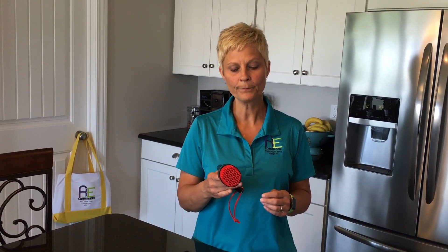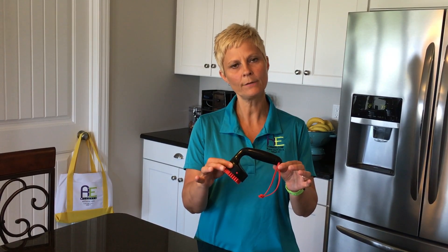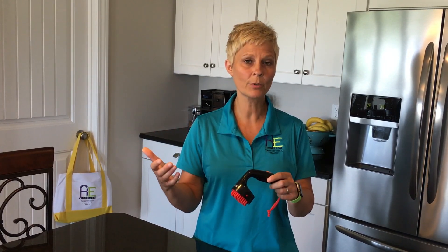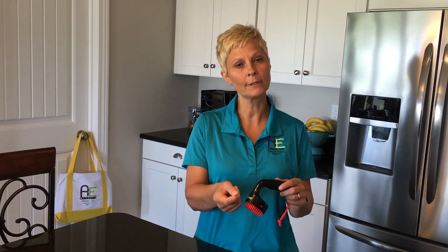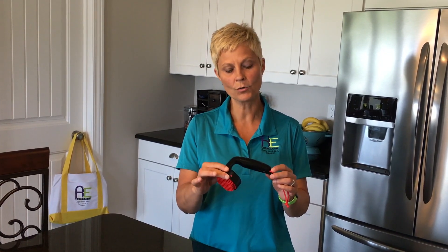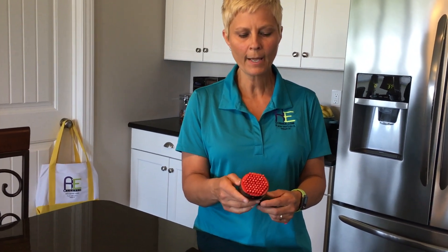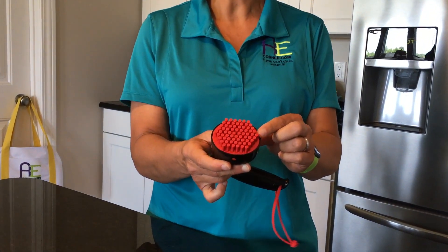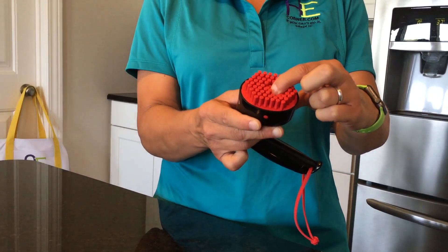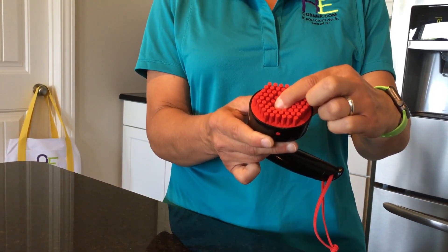So this is a knob turner, and what I want to show you — number one, it has a lengthened handle on it for a better lever arm when you're going to turn something like a deadbolt, the knob on a stove, or a little lock on a doorknob. It also has these little hard plastic columns in it, and as you press into what you're wanting to turn, it is going to conform around and grip it and help you turn that object.